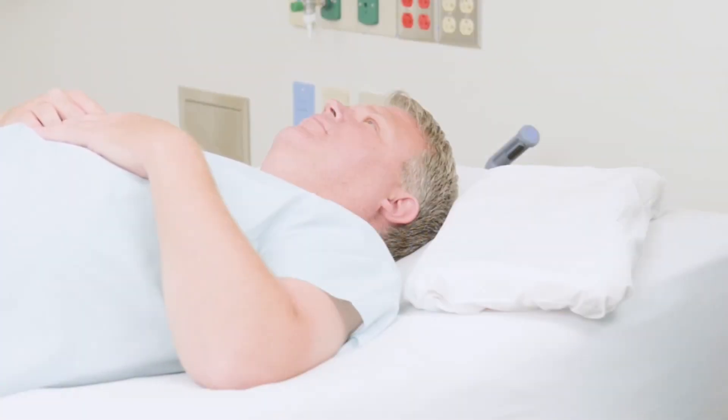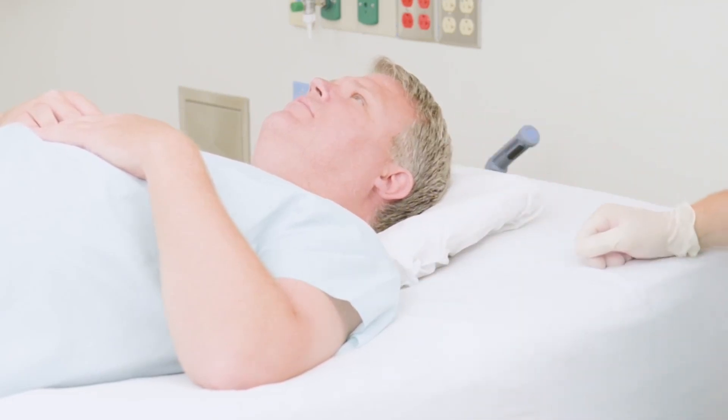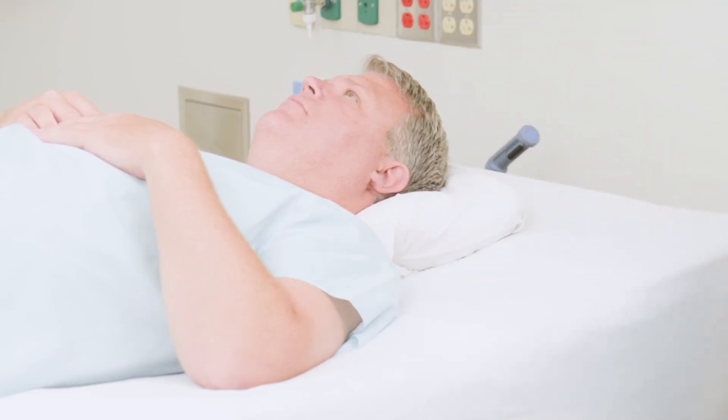The small utility positioners can be used to support the head and relieve pressure on the occiput. Always start with the positioner flat and always use a pillowcase or thin sheet to cover the positioner. Place the positioner under the head and align it with the top of the shoulders. Mold the positioner into both sides of the cervical spine. This anchors the positioner under the head and creates the proper amount of support for the spine.